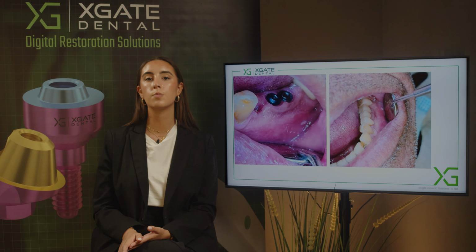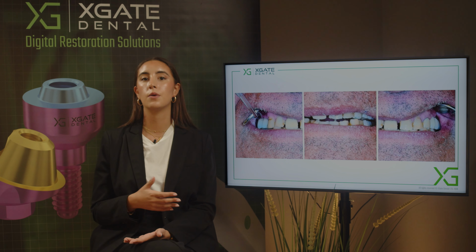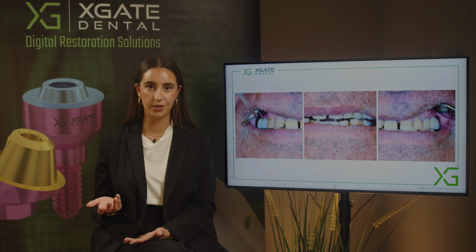You already have the smallest multi-unit possible. You can see them peeking out of the gingiva. We just close the small channels and you make the screw channels as small as possible, so we use as little composite material as possible, and this way you won't see the screw channels in the long run. This is the end result, and probably the patient is going to want to change his frontal teeth. They want to have white crowns after all.